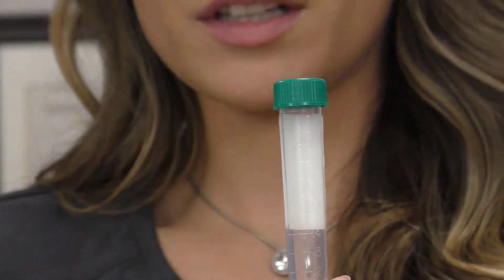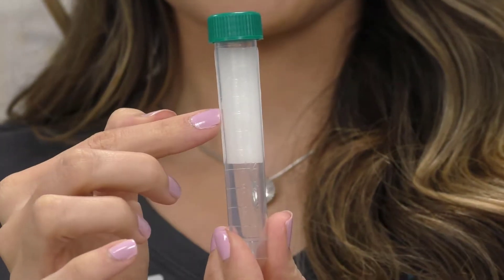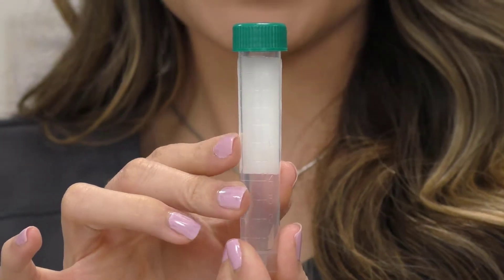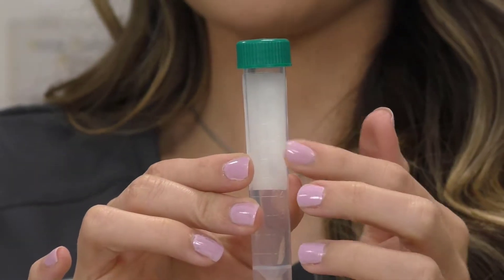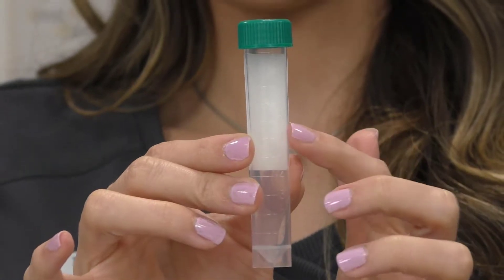For the actual saliva sample itself, we're going to fill all the way up to the mark that has the 7 next to it — you're going to take 7 mLs. I know it's a lot and it takes a little bit of time, but we have to have enough to adequately test the hormone levels, so we're going to go up to the 7.